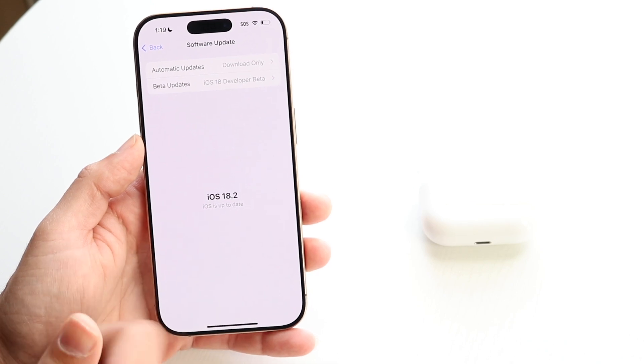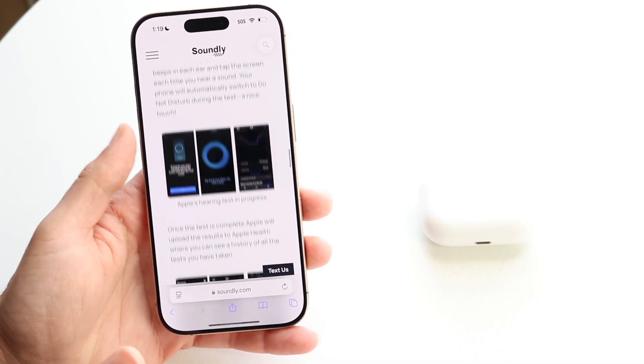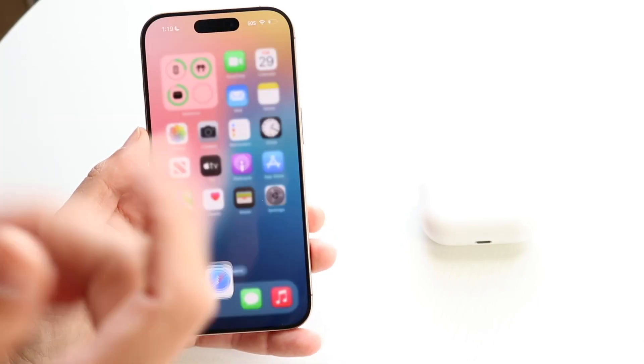If you're on iOS 18.2, that should work as well. I'll be following the instructions from soundly.com, so shout out to them. They supplied a lot of images so we can walk through their particular steps, but it's basically the same thing.